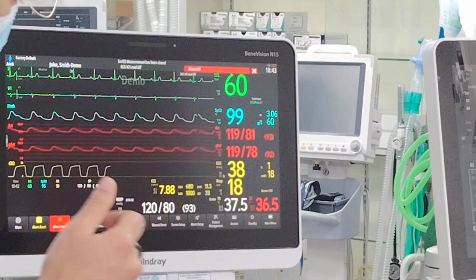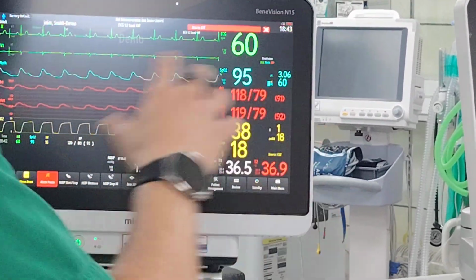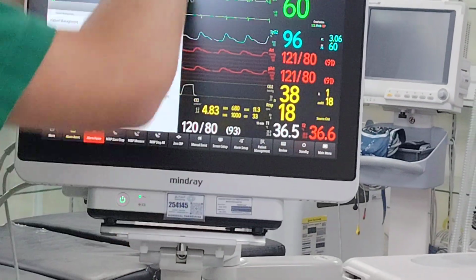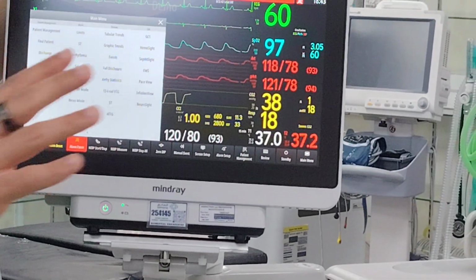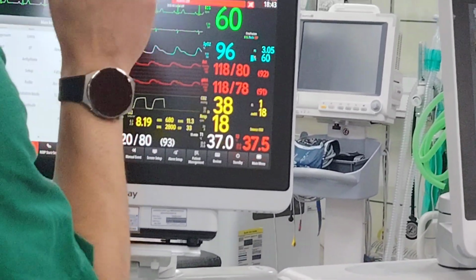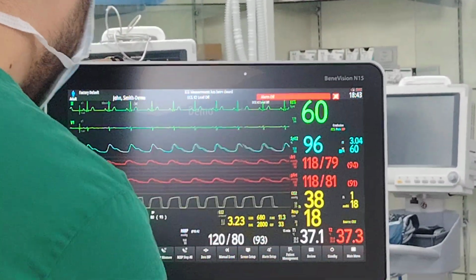Okay, let me now also fix this, so I can teach you a few things. And what I plan with the engineer is I will finish the configuration, copy paste it in all your machines for it to be all looking the same. Okay? Yes. So just give me a moment. What do I want to do?